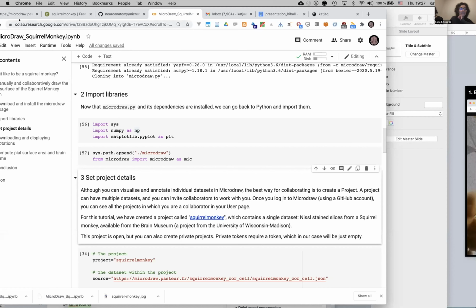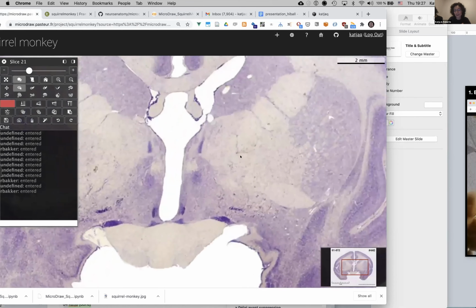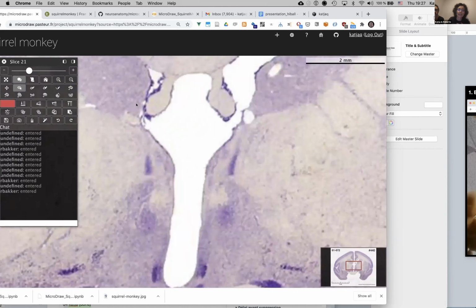What's nice about it, it relies on a system where you never see everything at once. Here, what you see is the big image, the full image at once, but then when you zoom in, it's a pyramid of pixel tiles. And so it only renders what you see on your screen right now. So when you zoom in and out, it's super fast.